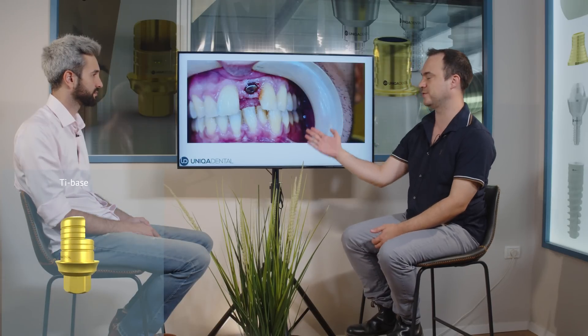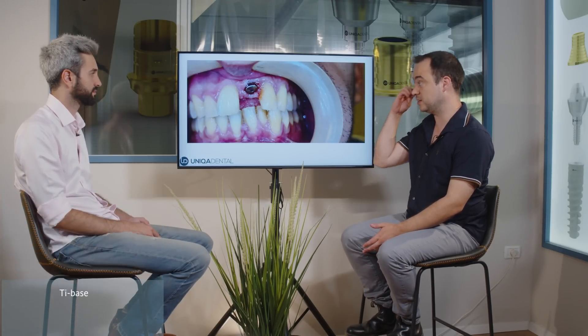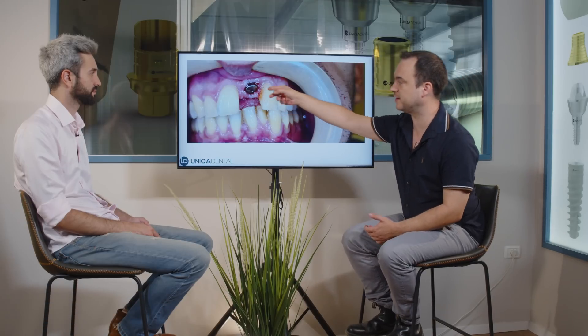We placed a crown on a T-base, and because the angulation of the implant is a little bit improper and there is still not enough gingiva in the distal part of this tooth, we've added a little bit of pink color to mask it — on the crown itself.